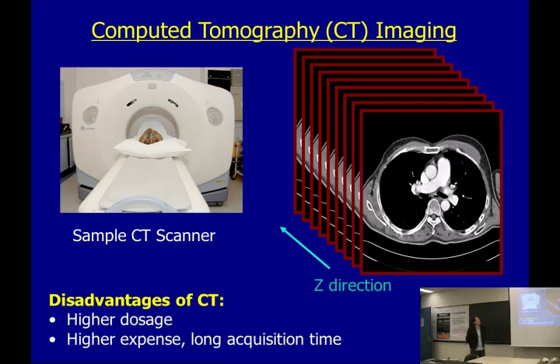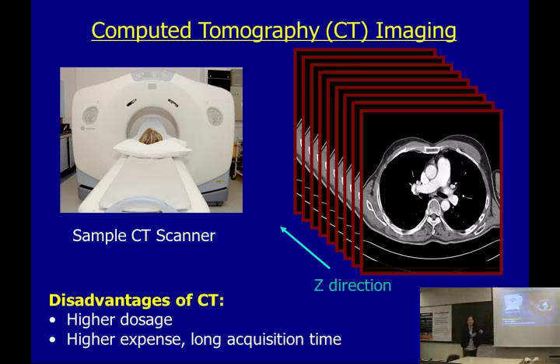This is three-dimensional computed tomography, which we also call CT. CT was developed in the 1970s, and it is now used very commonly in hospitals. This is a sample CT scanner. The patient lies down here, and inside this gantry there are detectors and X-ray tubes that rotate around the patient to take multiple projection images. It's like taking many projection images around your object, and then we can do the reconstruction. This way, we can show sliced images passing through your object. You can imagine a sliced graph. For each slice, you can check if there's anything wrong. This is basically CT technology.